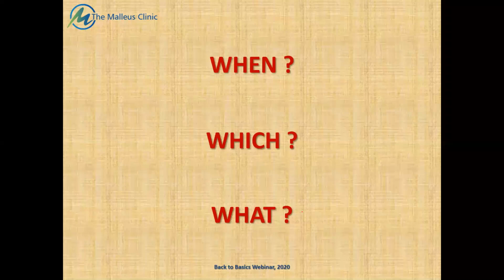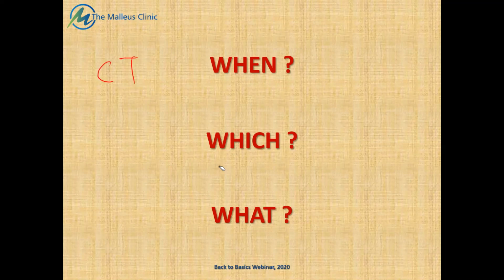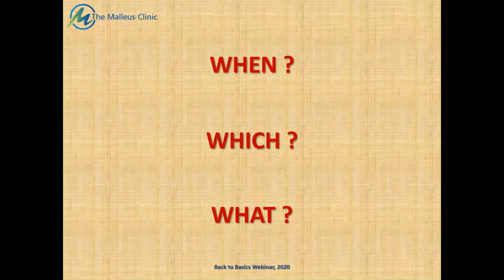And naturally, if it's a bony component, a bony lesion or a bone erosion, or the bony compartment of the temporal bone that you're looking at, your CT scan becomes your obvious modality of choice. But the moment it's the soft tissue part, the intracranial part, then it becomes the MR. So there's no one size fits all. It's your clinical acumen. What's the clinical background of the patient? What's the presenting symptom? What's the clinical sign? What are the other bedside investigations and investigations throwing up? That is what will help you decide when to do it, which one to go in for, and what to look for. And there are scenarios wherein you might have to use both of them.